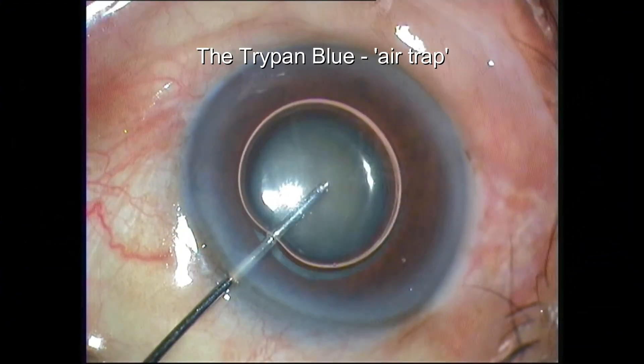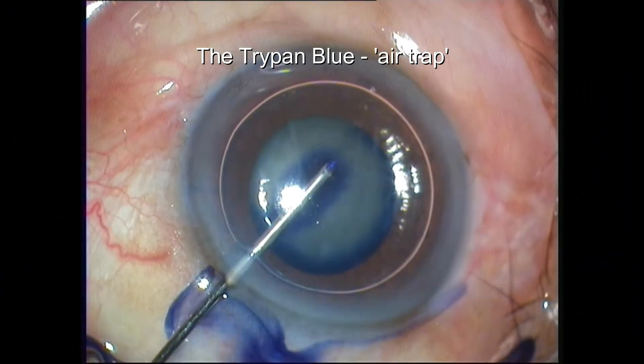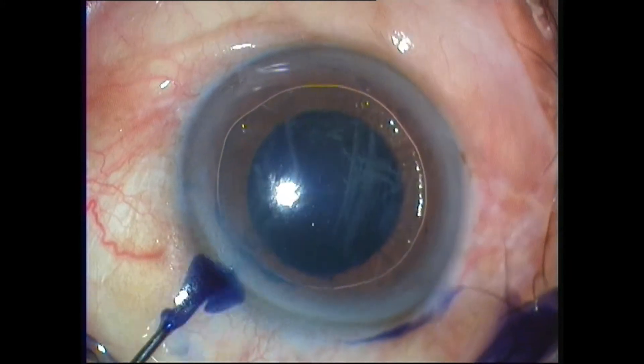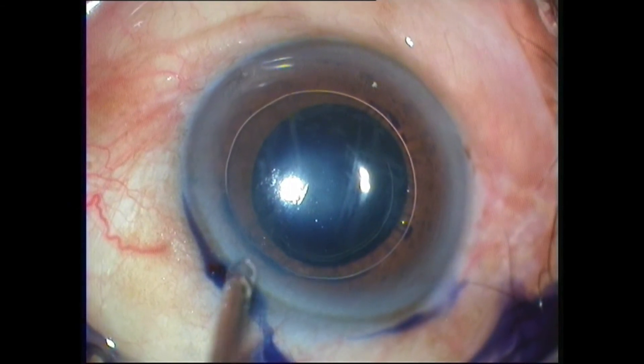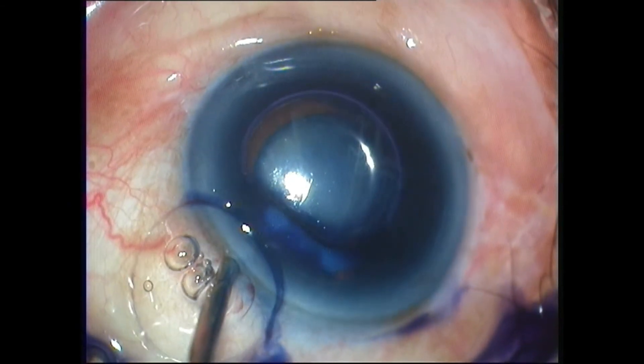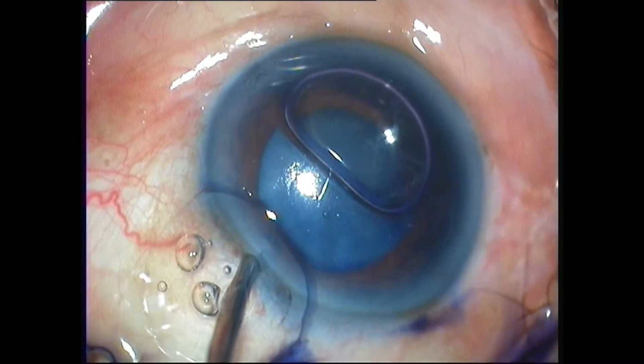I call this the Trypan Blue air trap. Under the right amount of air, a few drops of Trypan Blue is injected. You can see that the air rides over the Trypan Blue and acts as a trap. This will stain the capsule beautifully.